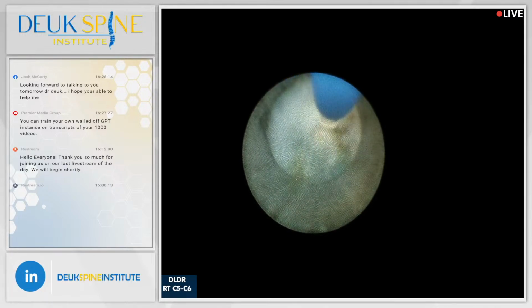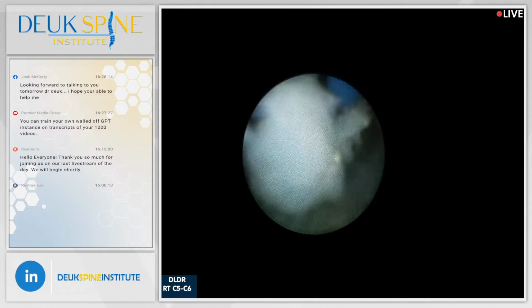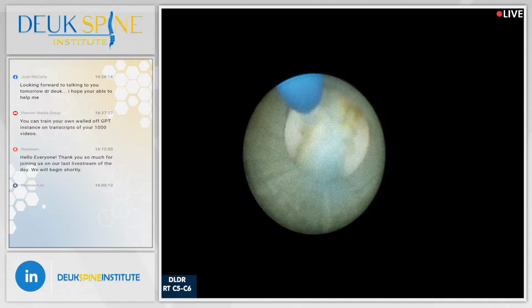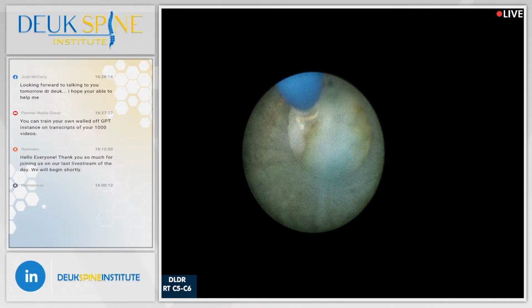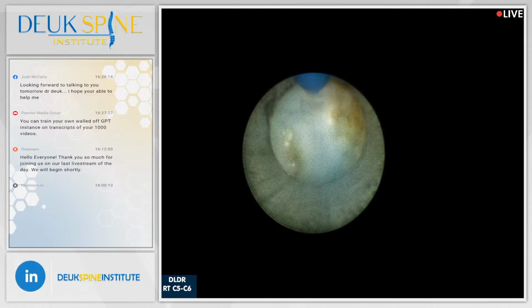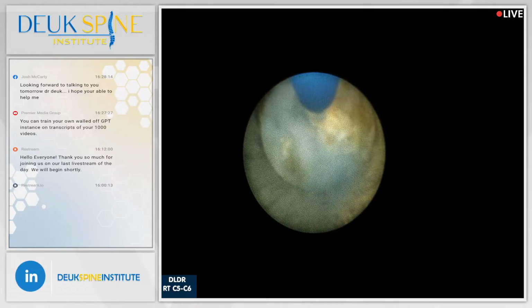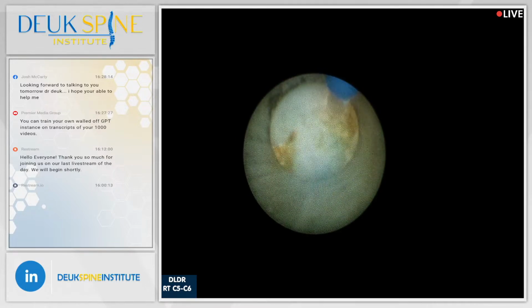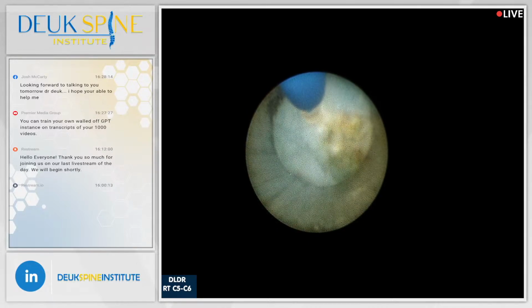So as I was saying earlier, the fiber that you're seeing, the glass fiber, is 0.5 millimeter. It's 550 micrometers wide, so it's a 0.55 millimeter wide glass fiber. That just gives you a little bit of scale on how big the fiber is. So that glass part at 12 o'clock that's moving around, I'm manipulating its position and making it remove herniation. That thing is 0.5 millimeter wide, just to give you an idea of how big everything is for scale. Lots of herniation over here. Lots and lots of herniation. All of this is herniated disc.